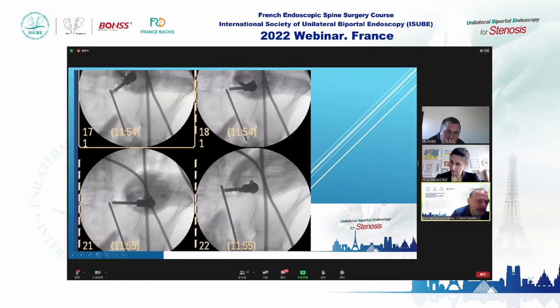You can see here — I check with fluoroscopy that we are right-sided at the L5-S1 space. You have to check this because you can miss the level, and it is very easy to do so.